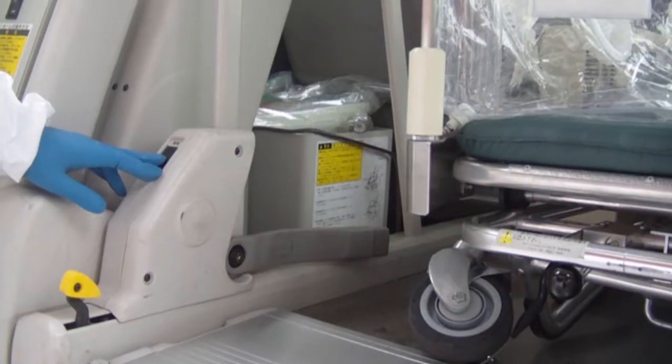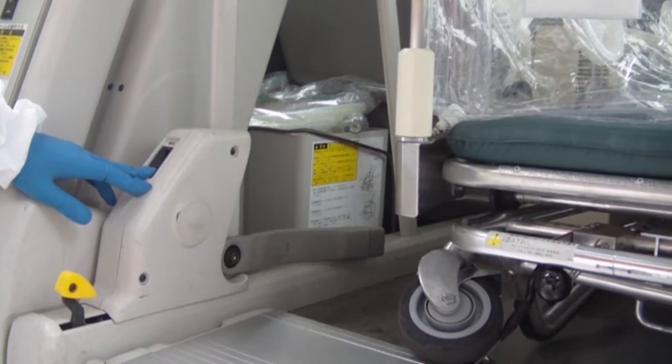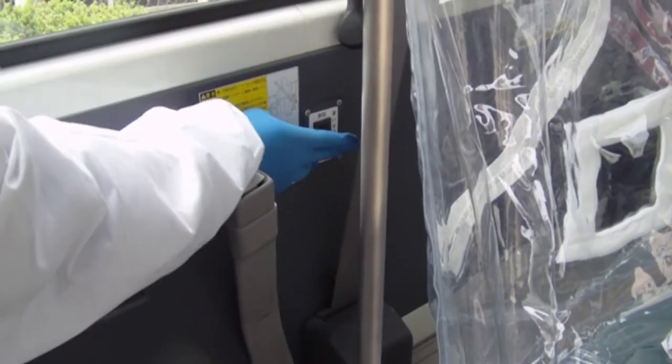Let's unload from the carrier car. The lock button is turned off.